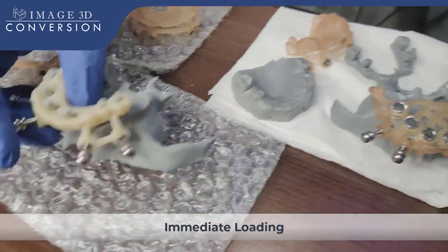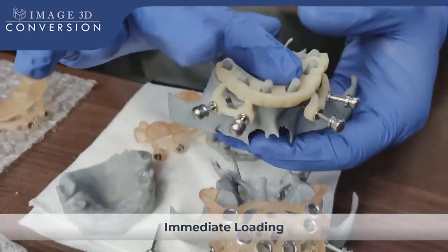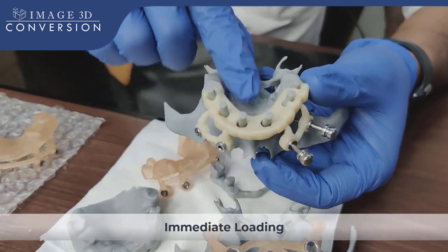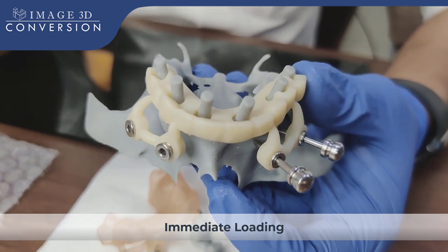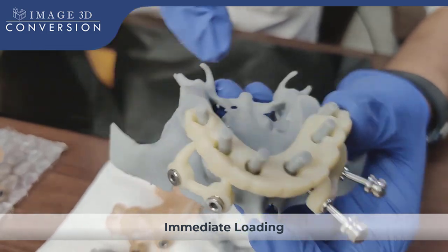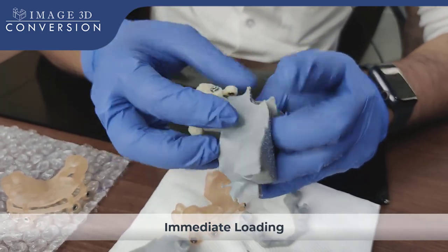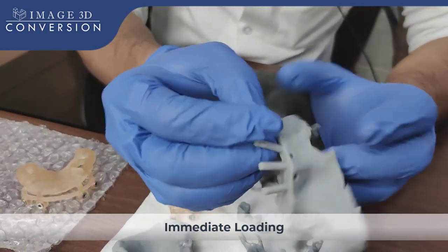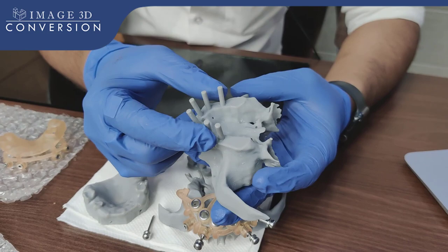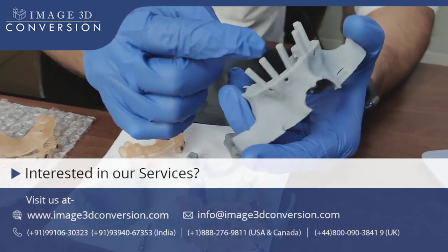For immediate loading, you just need to remove all the fixation pins. This is another model for backup. With the pickup holes, we plan one conversion from the existing denture — we converted the existing denture into an interim prosthesis with the pickup holes. We fabricated one model with all the abutments. We plan with straight abutments. We fabricated this model with the existing abutments and the reduced bone.